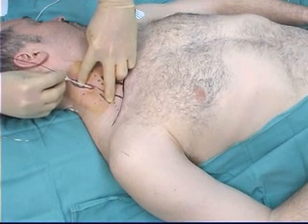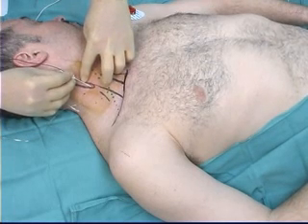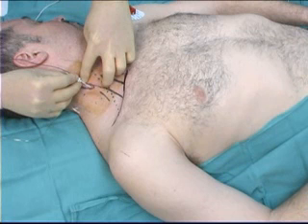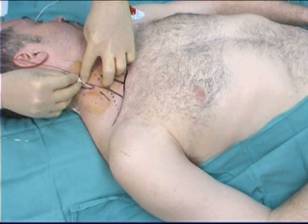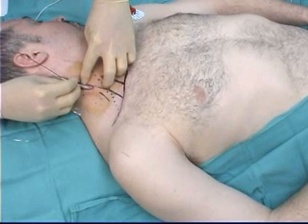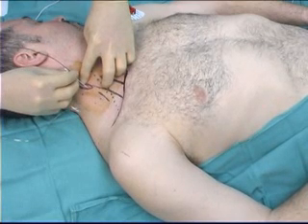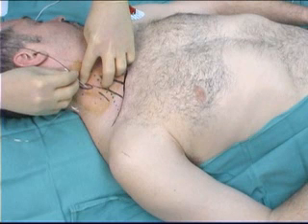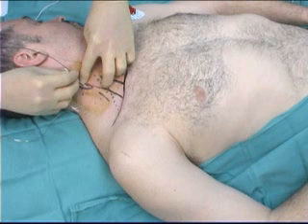The needle enters behind the sternocleidomastoid muscle approximately midway between the clavicle and the mastoid process, aimed at the brachial plexus deep to the middle finger of the operator's left hand. The needle enters longitudinally, typically aimed approximately at the nipple on the ipsilateral side. If the needle is aimed too anteriorly, the phrenic nerve will be stimulated and an unmistakable diaphragmatic motor response will be noticed. The nerve stimulator is typically set to 1 to 2 milliamps, 2 Hz, and a 100 to 300 microsecond pulse width.